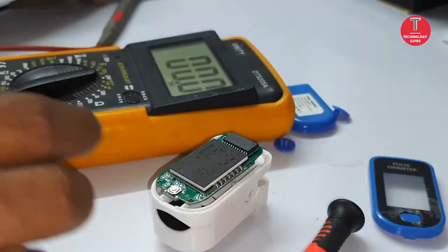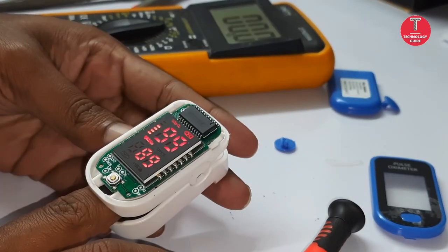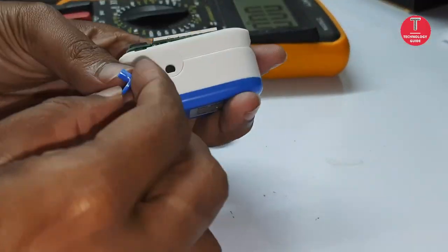Welcome to Technology Guide. In this video, I will show you how to disassemble and repair solutions of an oximeter at home. We can make it by taking simple steps.